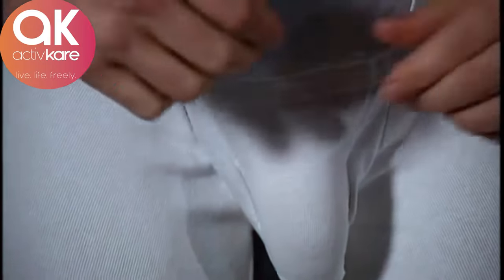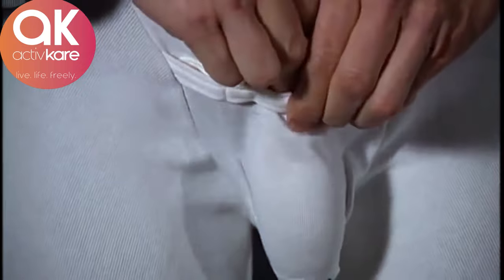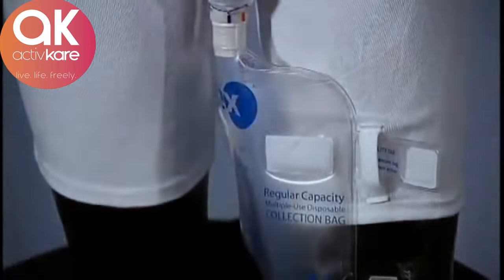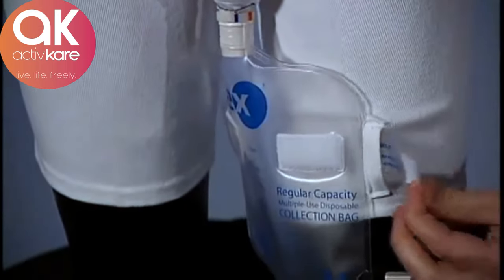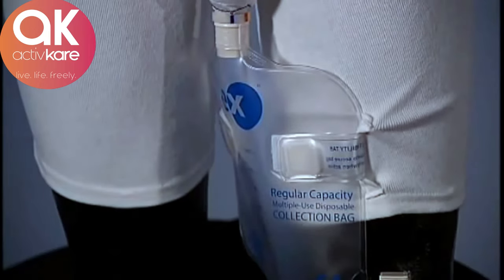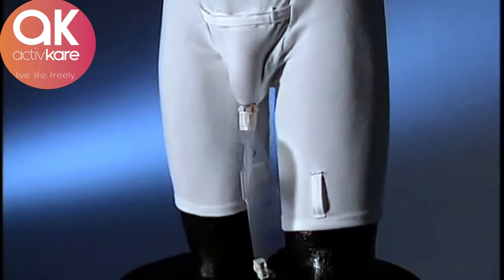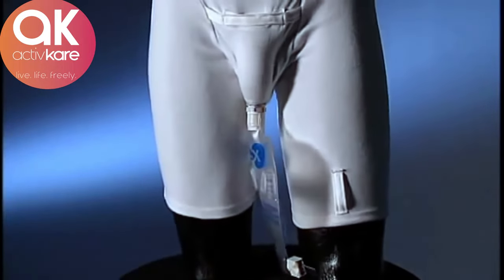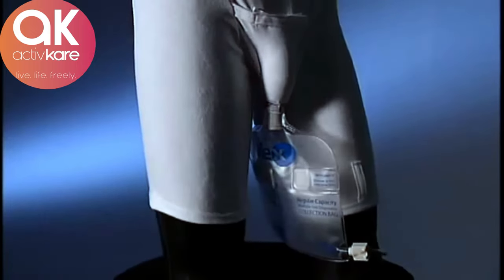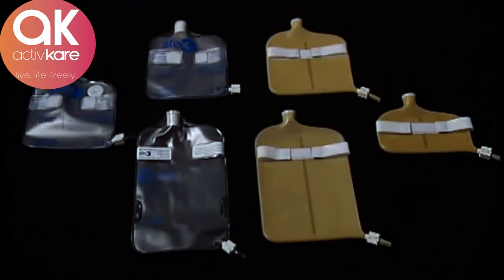Since there is no adhesive or pressure, simply unsnap the fly for easy access. For additional stability during high activity levels, use the unique tabs on the bag to secure it to the briefs. During normal activity or sitting situations, we recommend you let the bag hang free to improve flow. Several collection bag sizes are available for various situations, depending on your needs.